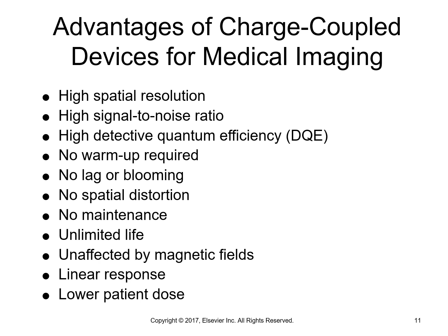No lag or blooming. Lag is a delay, obviously, in the capture of the image and transference of that image. The conventional video camera coupled with the image intensifier did have a lag time. Okay? Blooming is like a streaking artifact of brightness. Part of it is the conventional television camera, but part of that was the CRT. Now the early CCD did suffer from blooming, but they re-engineered it and figured out how to fix the blooming artifact that would occur with the early CCD.